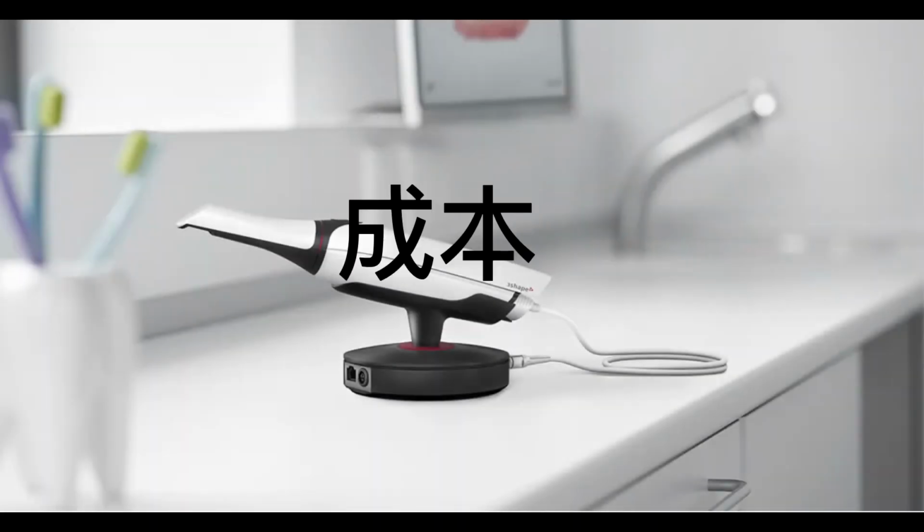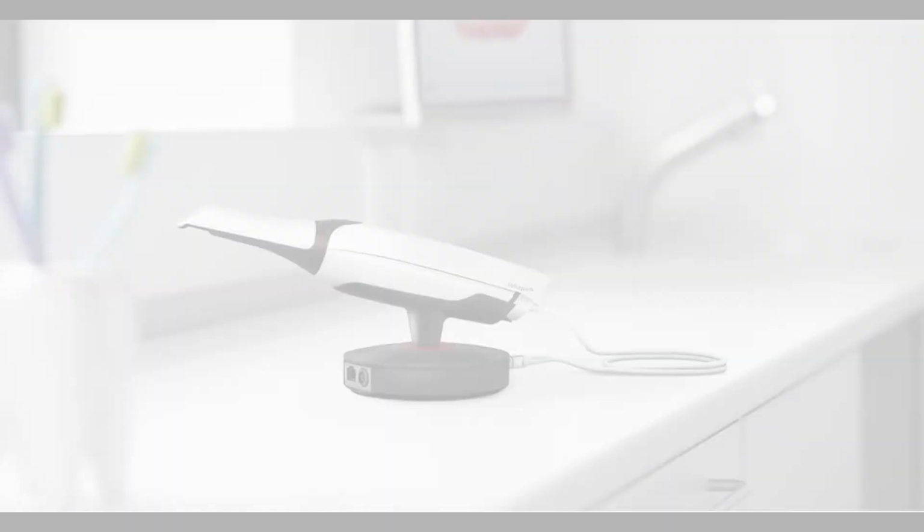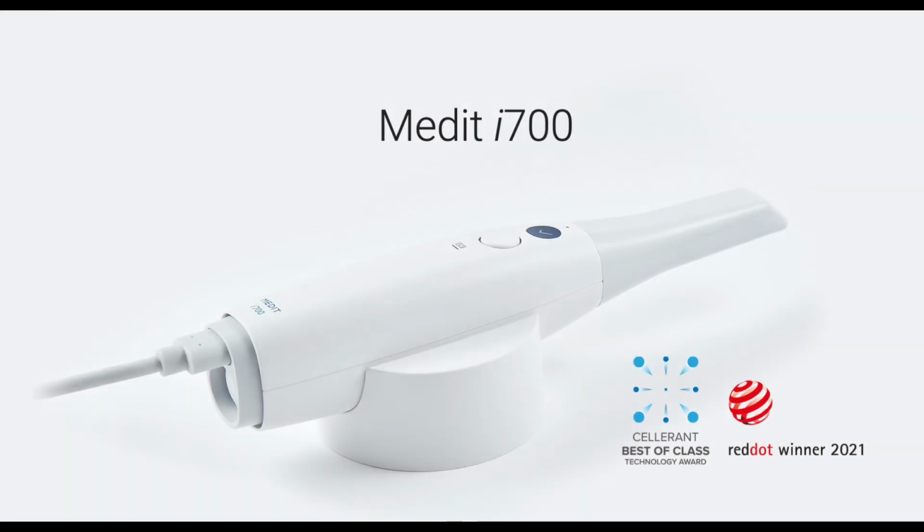In terms of cost, the confocal technology scheme requires a precise optical path, MEMS galvanometer, camera and depth of focus control device. Among them, the most expensive is the depth of focus control device, which requires very high accuracy, and putting them into a small mouth scanning cavity is very high in terms of material cost, process cost and labor cost, so the terminal price of Trios is generally about $23,000. The 3-dimensional structured light scheme only requires a projector and 2 cameras.